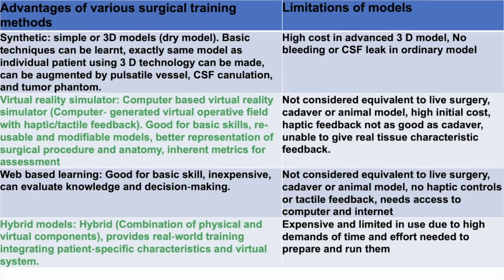These are not considered equivalent to live surgery, cadaver, or animal models. There is initially a high cost. Haptic feedback are not as good as cadaver, and these are not able to give real tissue characteristic feedbacks.